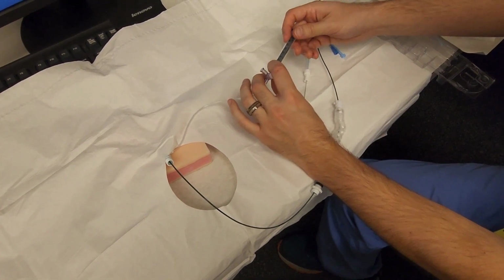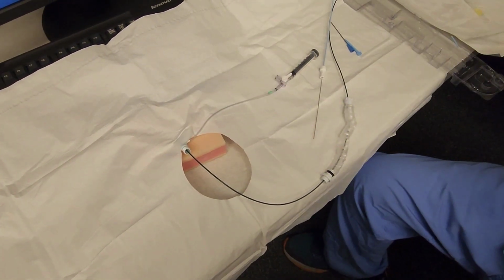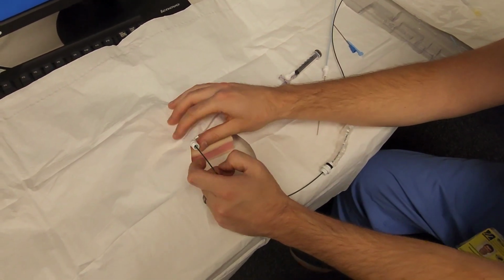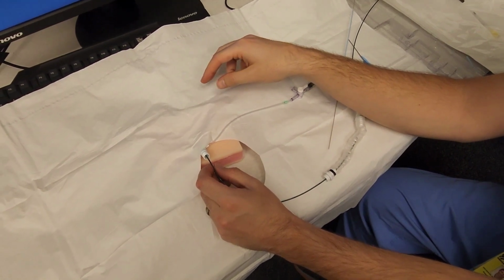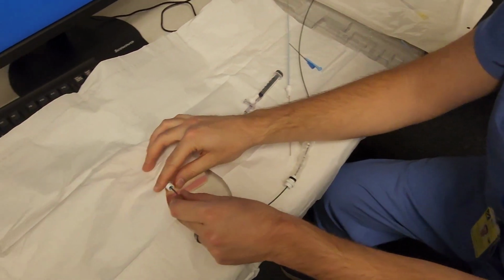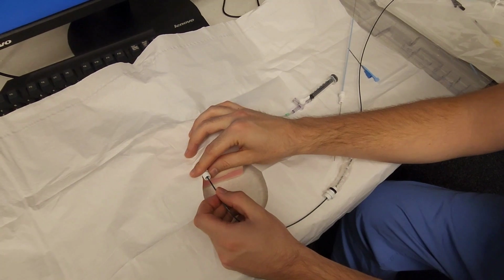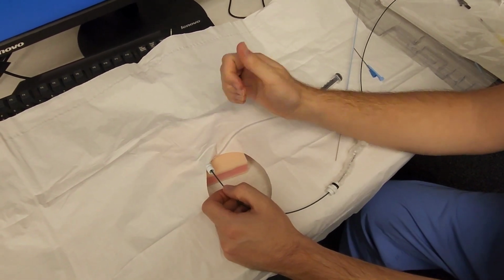And then lock the stopcock. Once the balloon is up, slowly keep advancing. And at this point, you're going to be watching on the monitor on V1 for pacer spikes and for ST elevations. And once you get that, you'll know that you're paced, and then you need to check for actual capture by checking the patient's pulse and make sure it's paced at the rate you have it set. So the goal is to basically float the balloon into the right ventricle. So with the balloon up, you're slowly going to keep advancing until you get capture on the monitor.